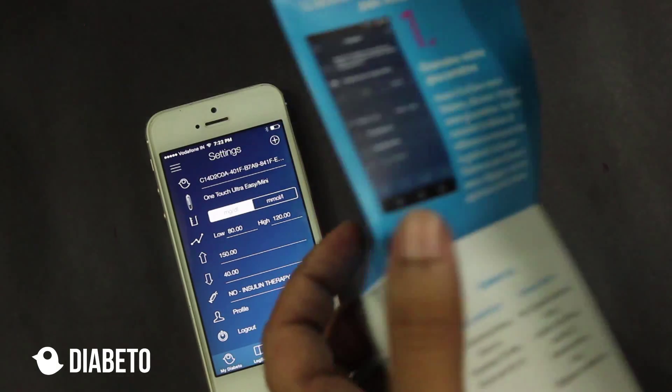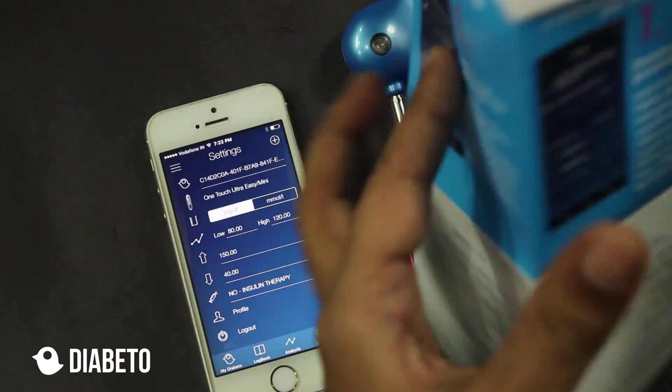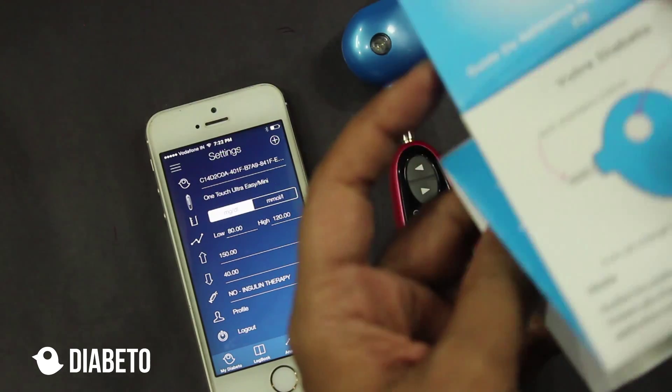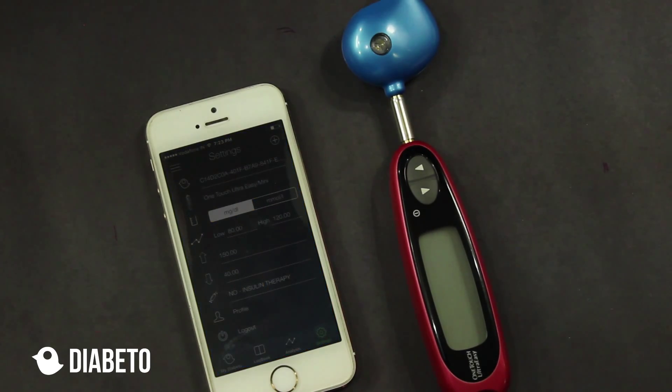At the same time, if you want more details, you can go online at diav.to and in the download section there are manuals — the quick reference guide and a detailed manual are also given. You can just read the manual and get everything set. That's it about syncing the readings from the glucometers. If you have any questions, you can get in touch with us at contact us at diav.to. Thank you very much, bye.